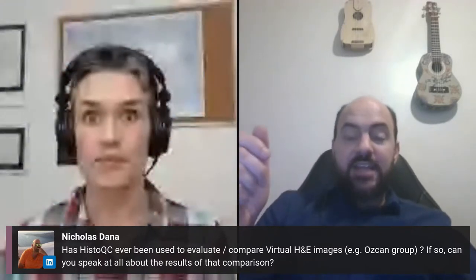for quality control? So in the clinical diagnostic systems that I know of, there's already a person that's doing quality control, right? There's already a person. This is a tool for them. It's them, but now they're going to be 100 times more efficient, right? And they're not going to have to look at every single slide laboriously or randomly select slides and hope that they get a good one. Instead, they're going to say, here's the list of the next 10 slides that you should look at. And we show that that's probably a pretty good way to do this.